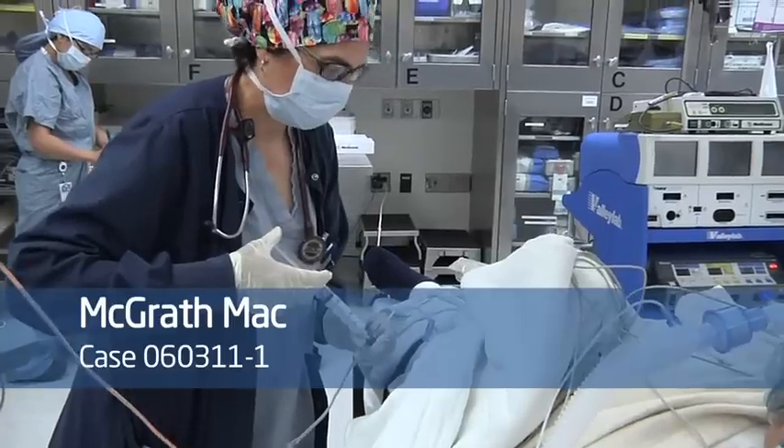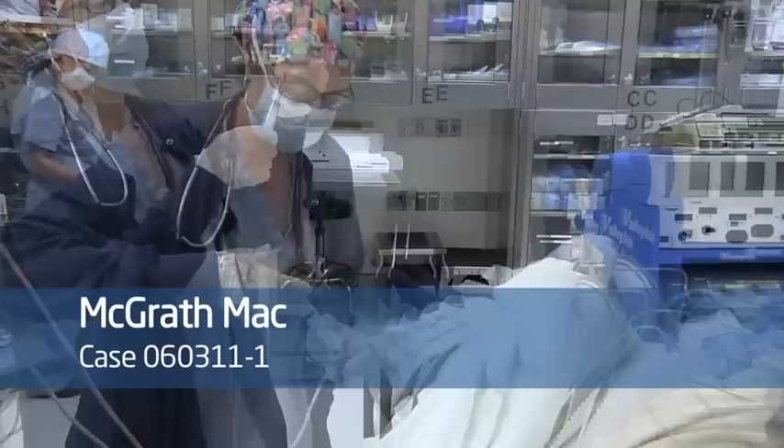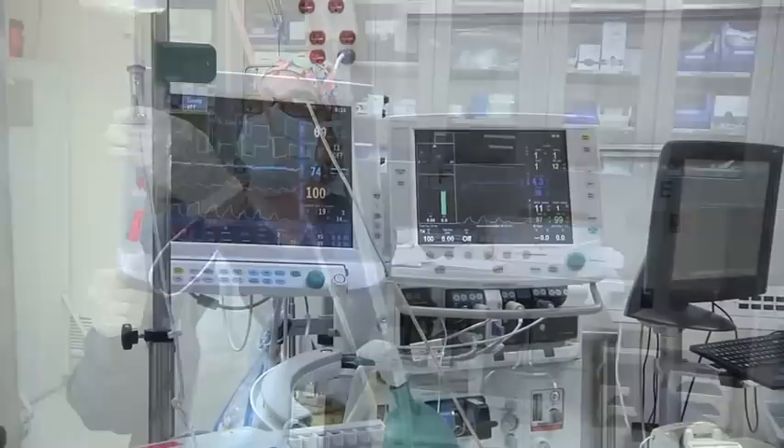He's already at 94. Once he loses consciousness, we're watching the vitals and the breathing. It's dropping — good. And he's not breathing.